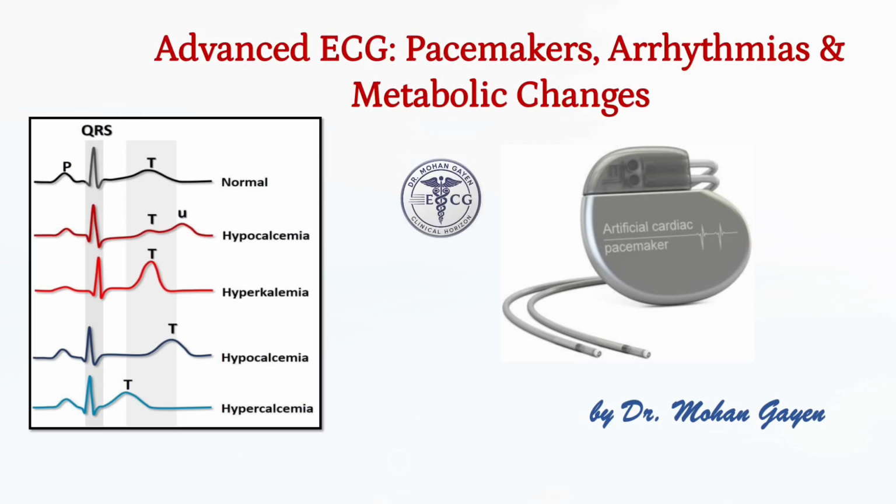ECG interpretation isn't just about detecting heart attacks. It helps us understand a wide range of heart and body conditions. In this session, we'll move beyond ischemia to explore advanced ECG patterns that provide key medical insights.